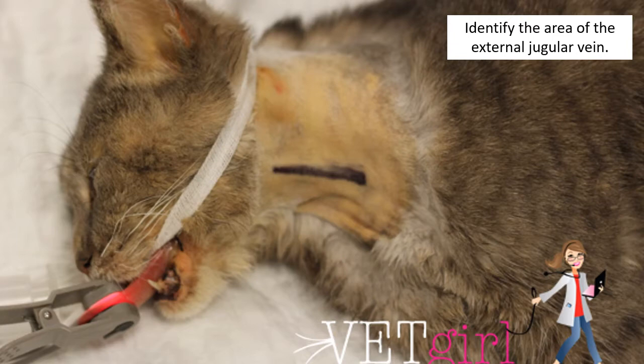You may ask, Doc, those markers are not sterile. Are those pentel pen? But the site is sterile already. Why are we putting a non-sterile thing there? Well, the markers used in this case are what we call tissue markers. Tissue markers are manufactured and sold sterile for tissue marking during mass removals.